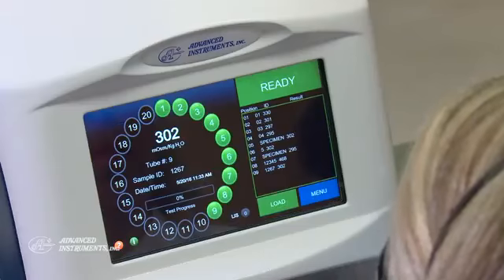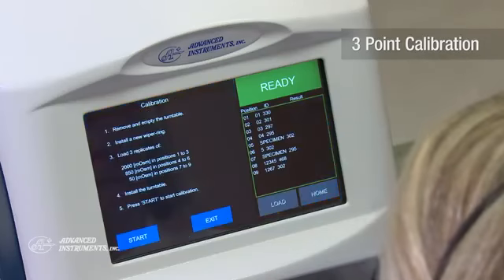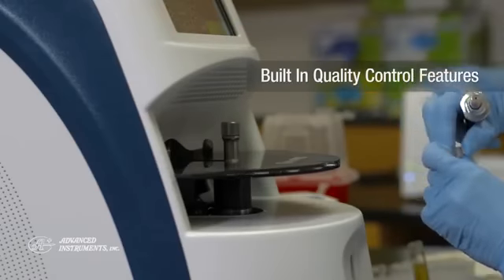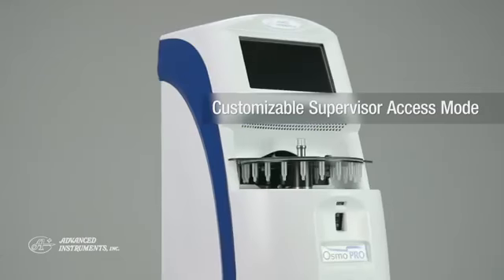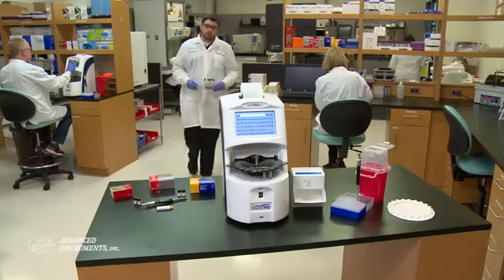OsmoPro utilizes a three-point calibration to assure accurate test results. Built-in quality control features deliver greater confidence in test results. OsmoPro also provides a customizable supervisor mode that manages operator privileges and access.